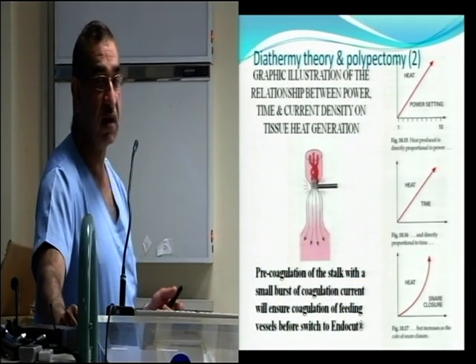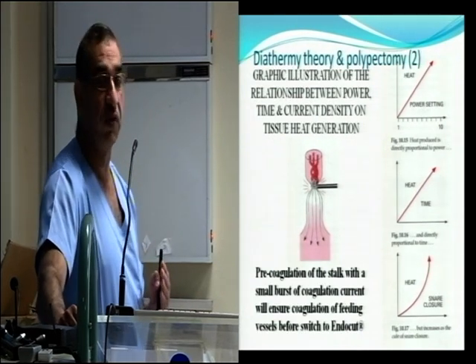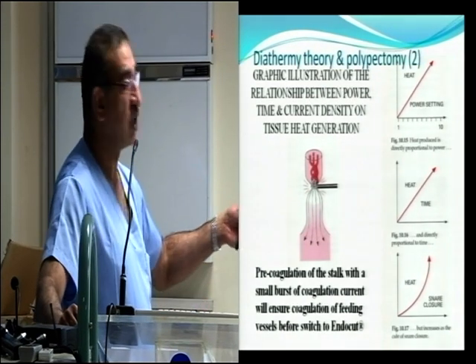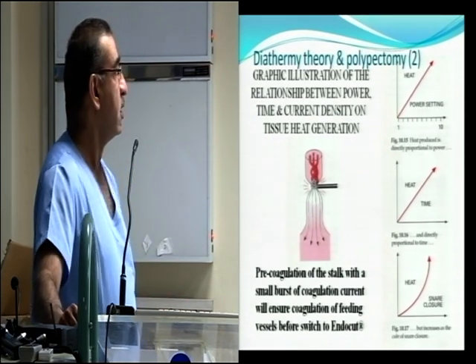Especially with the newer machines, you don't take your foot off the pedal, because the endocut current would not work if you try to do it intermittently. You press your foot down and keep it there, and it will keep on changing the cycles from coagulation to cutting current. So that's important.